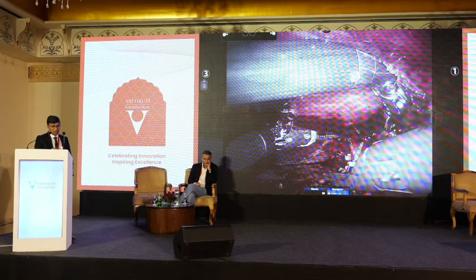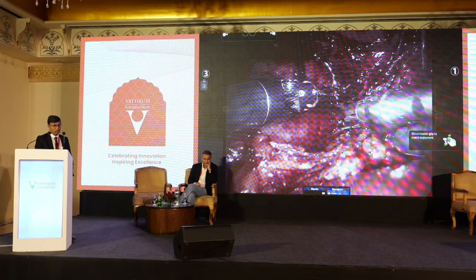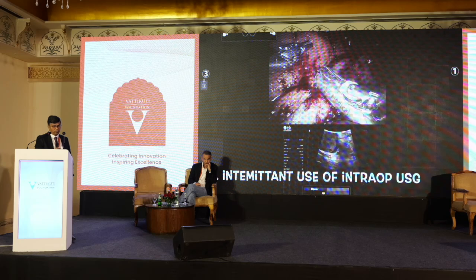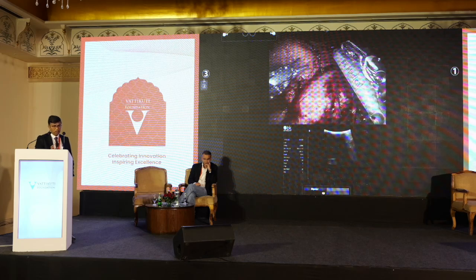So the major tip is that you need to be careful here because there are a lot of collaterals all around the IVC in thrombus patients. Once you do that, do an intra-op ultrasound and see that the thrombus is rounded off, so there's nothing beyond it. So you're more confident.